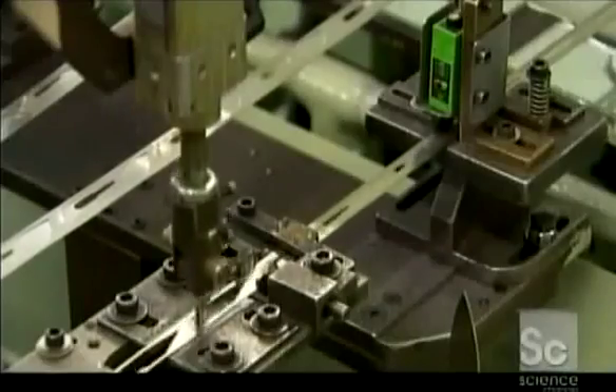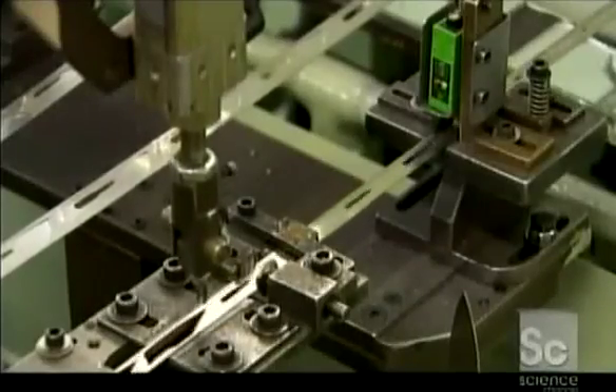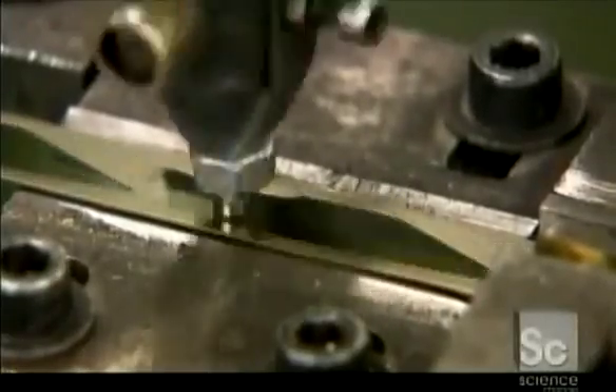Next, the blanks move through a punching tool that pops them from the strip and stacks them on a peg.